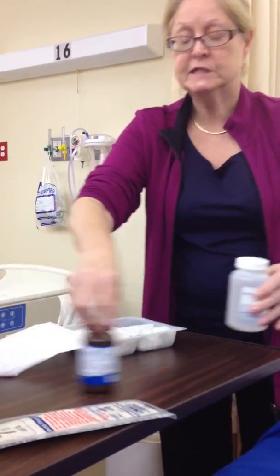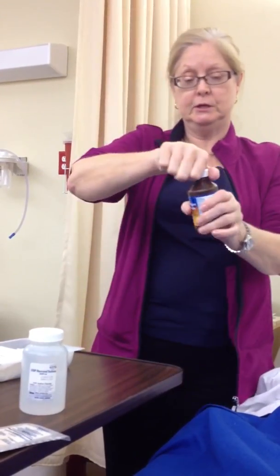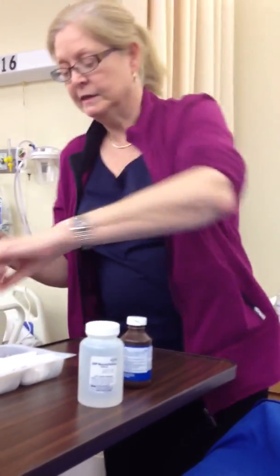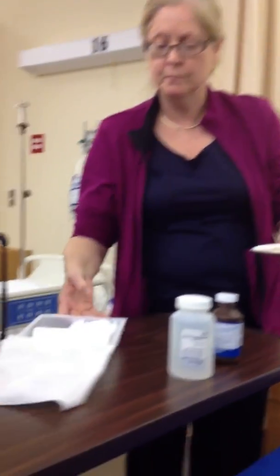And the very first thing that you want to do is think through your procedure. So open your containers, because if you don't, you might get caught at the end. You don't have to take the caps off, but just loosen them up. That cap came pre-loosened. Okay, and now I've got to get the gloves out of here. And then I'm going to go ahead and put my gloves on.